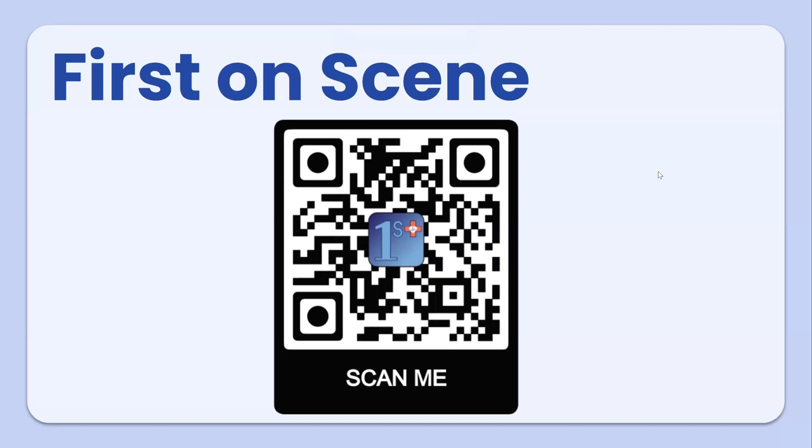You can download First on Scene by either searching for it on the App Store or scanning the QR code on screen now.